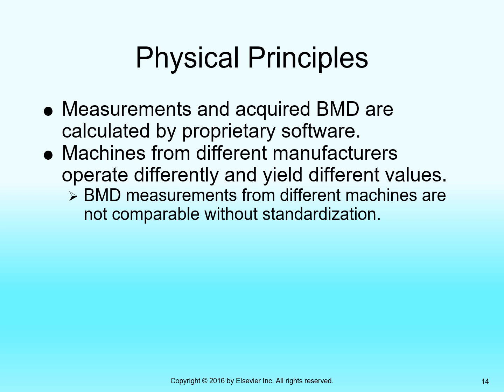Okay. Different manufacturers will have different methods, like different energy ranges that they're utilizing. As long as they use one low energy and one high energy and use a difference, their mathematics is similar across all softwares, but all softwares are not exactly the same.